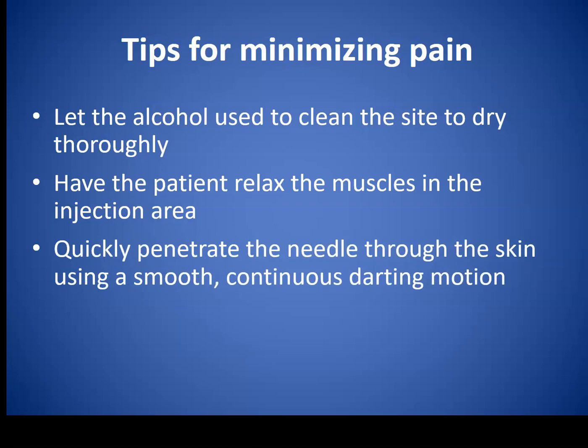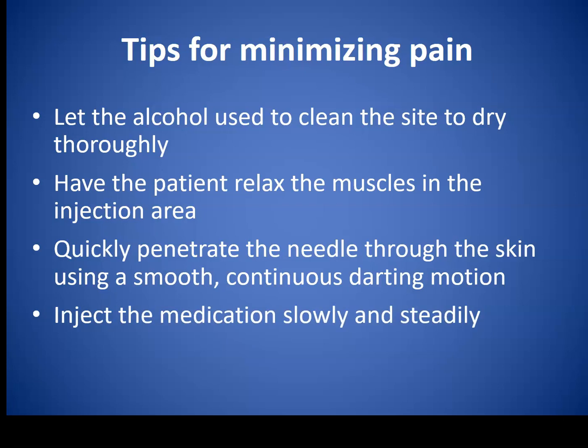Making sure that you are quickly penetrating the needle through the skin using a smooth and continuous darting motion will make a huge difference in the pain level for the patient. Okay? If you insert that needle slowly because you're nervous and you don't want to hurt the patient, you're actually hurting them more. So getting it in a quick, smooth motion, almost like you're throwing a dart, is going to be much more comfortable for the patient.